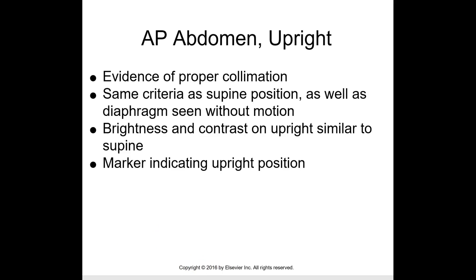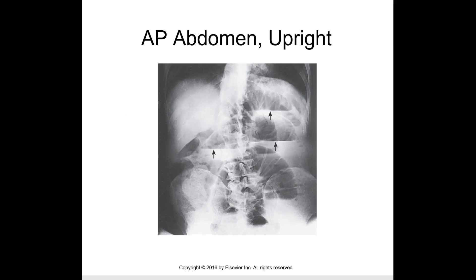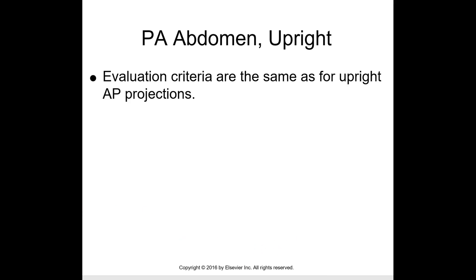For the AP upright, evidence of proper collimation follows the same criteria as the supine position, as well as the diaphragm seen without motion. The IR is centered two inches above the iliac crest. Brightness and contrast on upright is similar to the supine. The image should have a marker indicating the upright position — arrows are shown indicating upright, but once again there is no right or left marker.